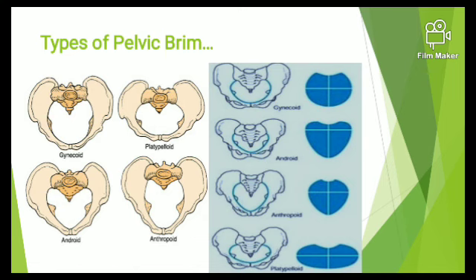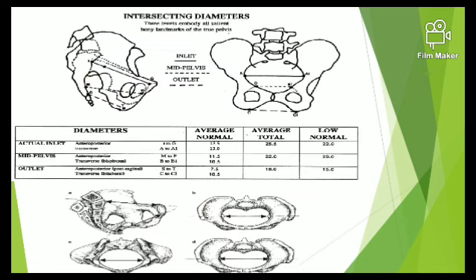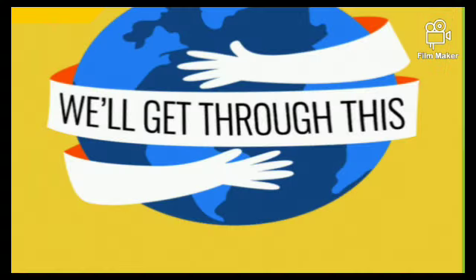You can see here the reporting format for our pelvimetric measurement. We can record the values, see whether they are in the normal range or not, whether it is permitting normal delivery, and what type of pelvic brim it is. That was all about our pelvimetric explanation.